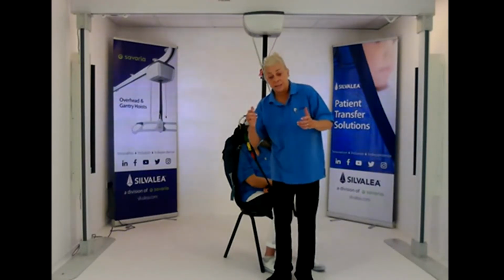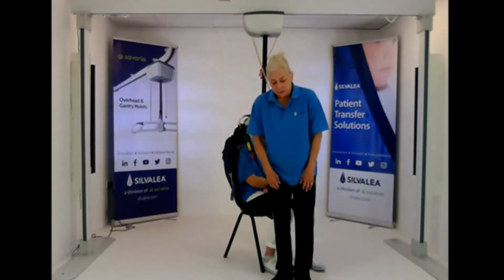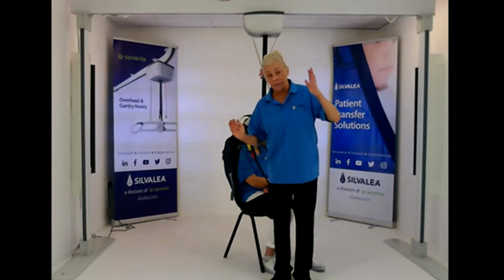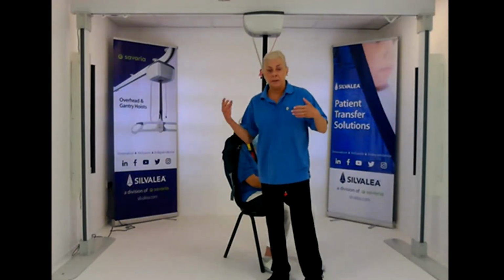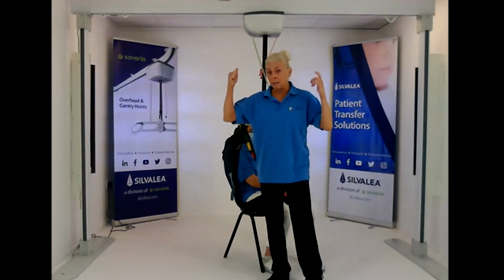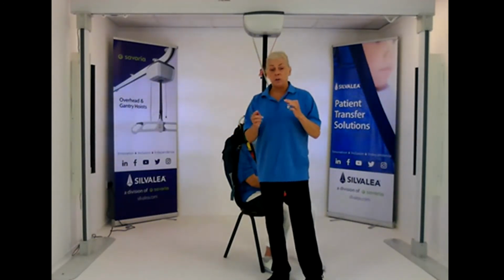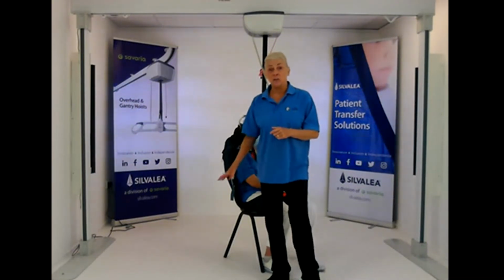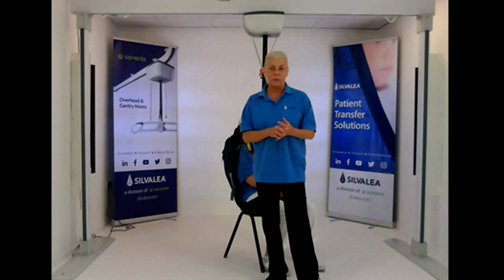If you've got someone with, as we explained earlier, severe curved kyphotic scoliosis, having the deluxe legs helps the adjustment of the hip tapes. Certainly, I know a lot of therapists are very inventive. They will have a shorter shoulder on one side to help counteract that disproportionate shape. So long as it's thoroughly risk assessed, the sling will certainly be able to do that. So yes, it's a good option. Certainly the deluxe leg, we've known has been very successful in that type of situation.